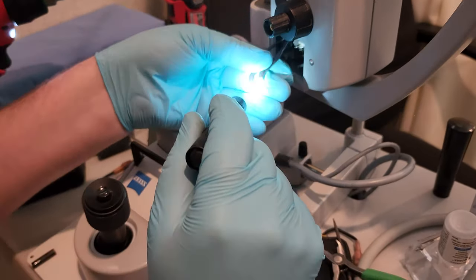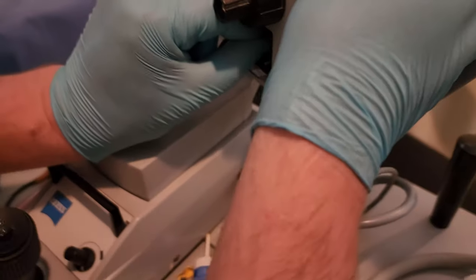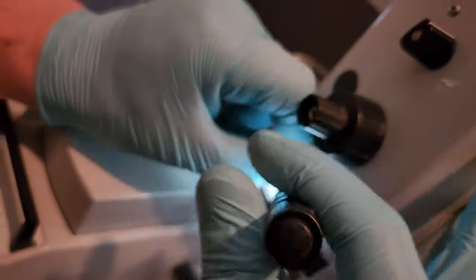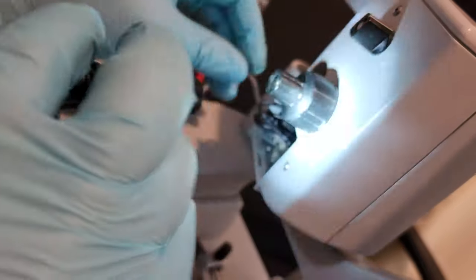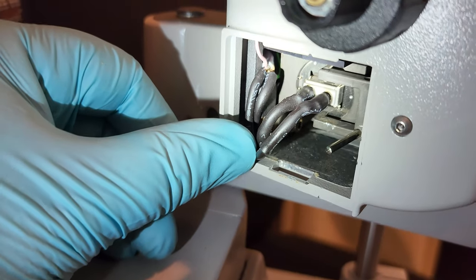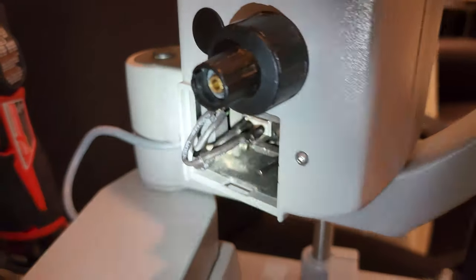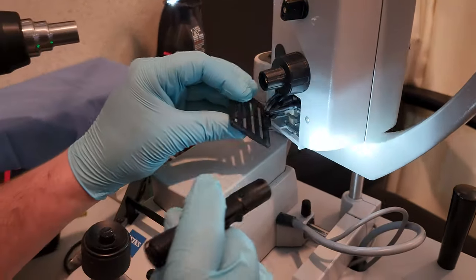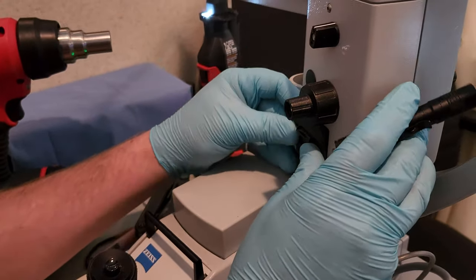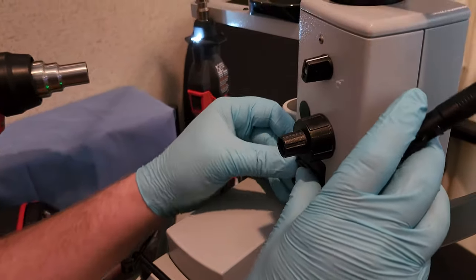Okay, so we had some garbage connectors for the bulb. Now we got some good connectors that push on, like so. Yes, nice. Then these wires will tuck down on the inside port, and that is a finished job. There's lots of tension on those too, look at that. Easy cheesy, man. Put this guy in. So, great. Tuck the wires. And that is how it's going to sit.